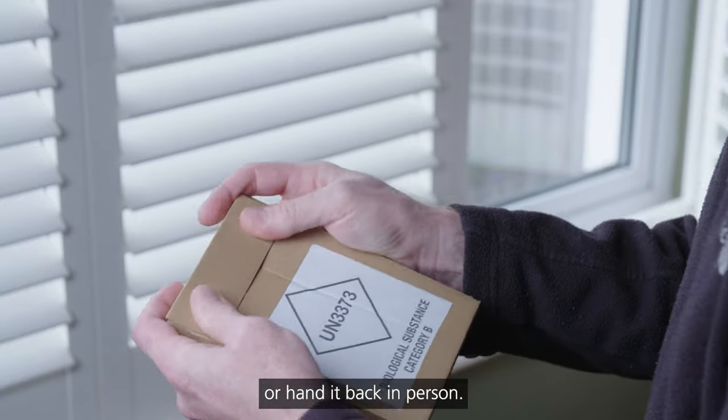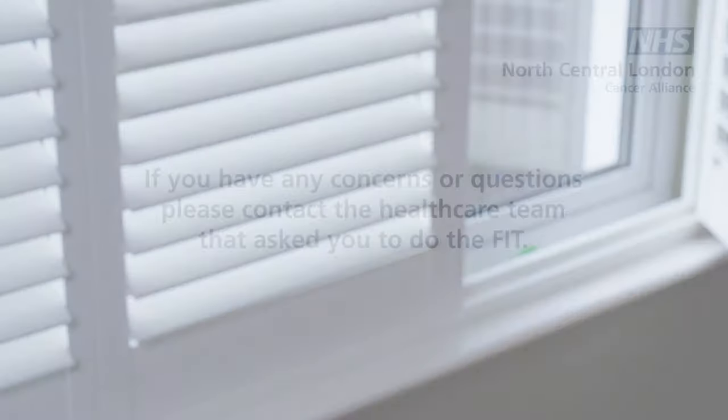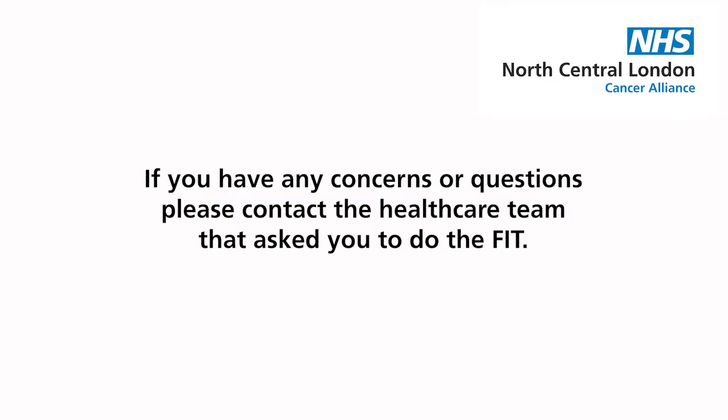You will have been told at the time you received the test whether you are expected to post the completed test back or hand it back in person. We will contact you to talk about the results and tell you what will happen next. If you have any concerns or questions, please contact the healthcare team that asked you to do the FIT.